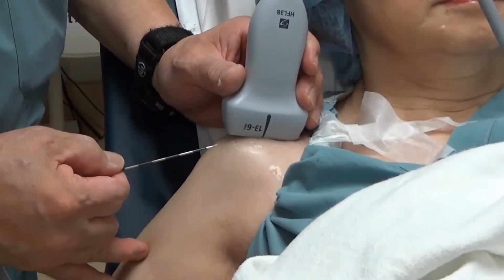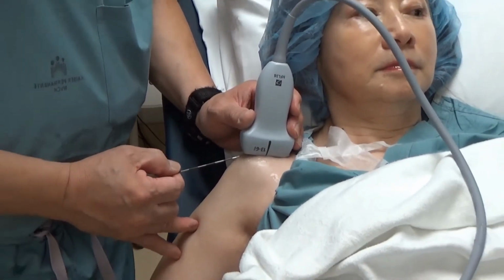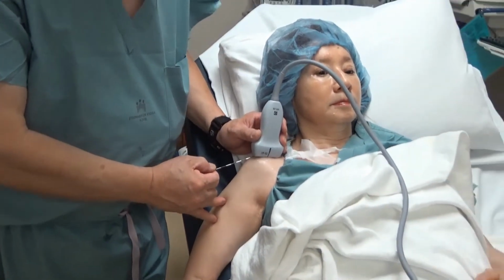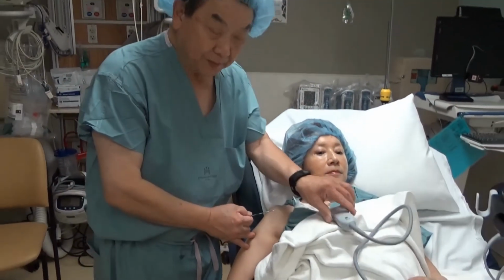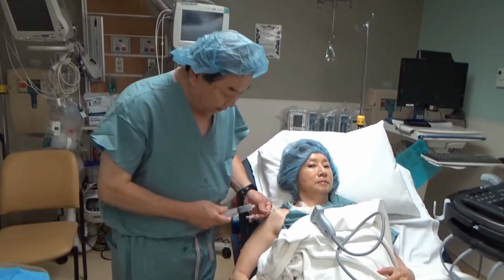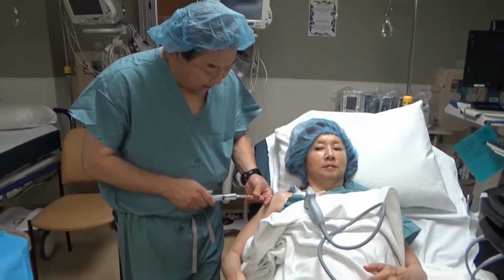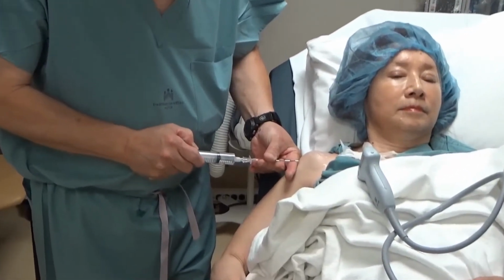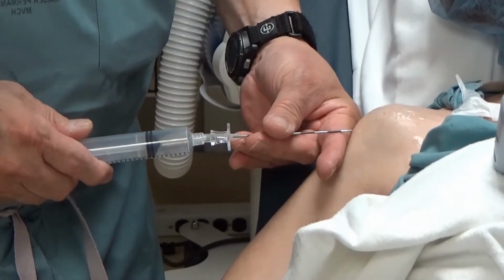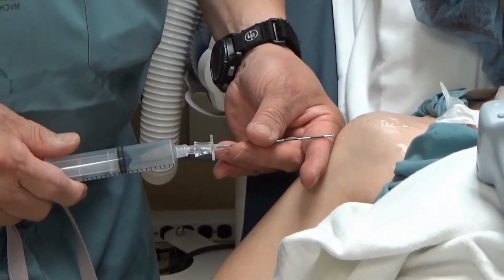Now, when we do this technique, after we fenestrate, we will then try to aspirate as much of the calcium as possible. The way that we normally do this is we have a large syringe which is filled with sterile saline, and then we will basically irrigate and aspirate. So we irrigate as we enter the calcium, and then we try to aspirate as much as possible. So this is a very simple technique.